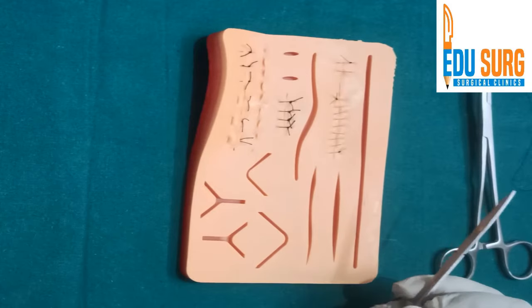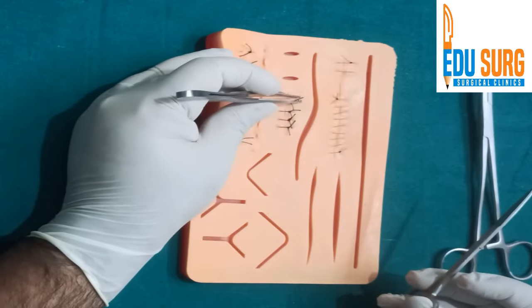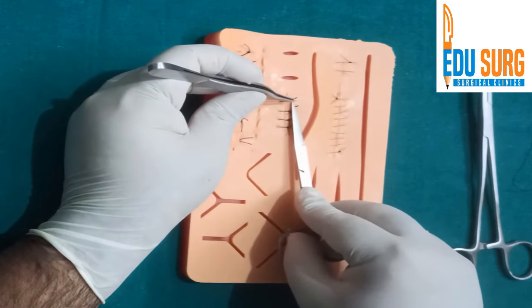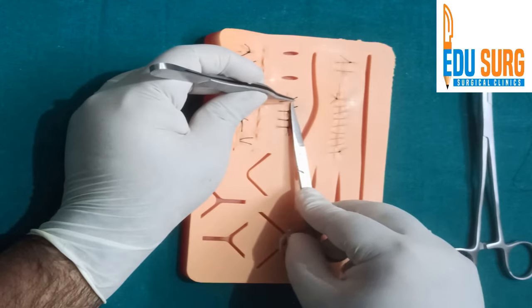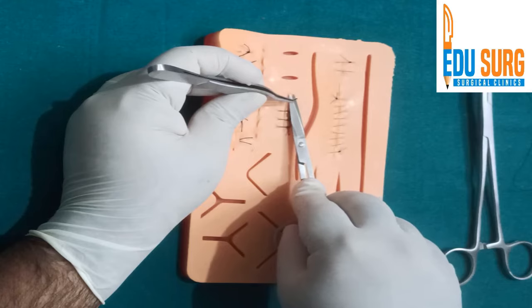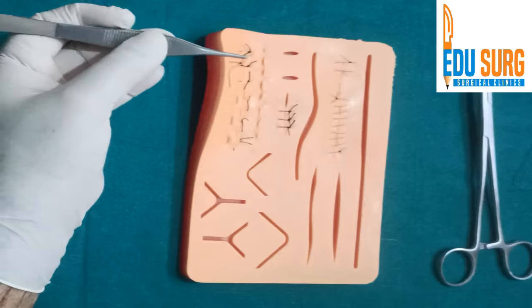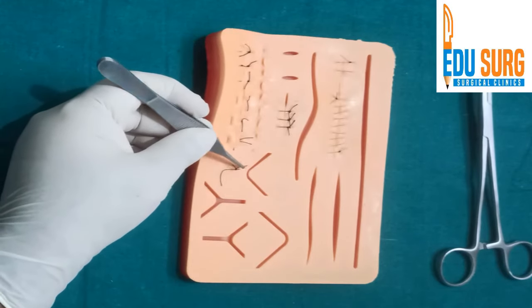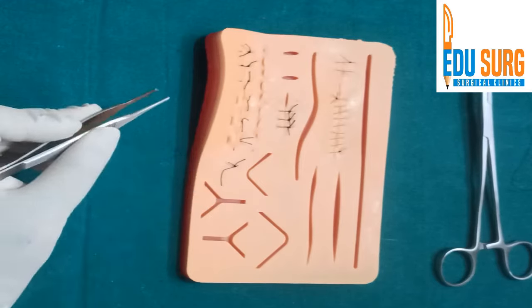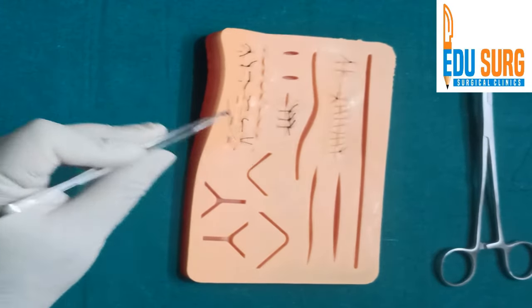When you are removing simple interrupted stitches, you hold this thread and pull the part that is inside the skin. Pull it a bit and cut the thread there. Once you have cut the thread, just pull it out. When you pull it out there should be four parts — one, two, three, four. If you remove a suture like this, you have not kept anything inside.